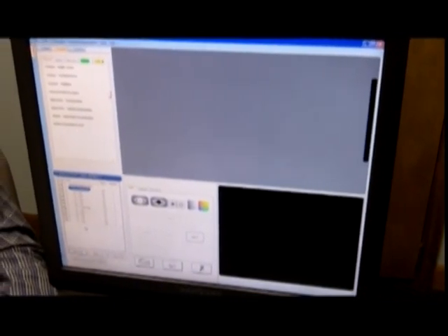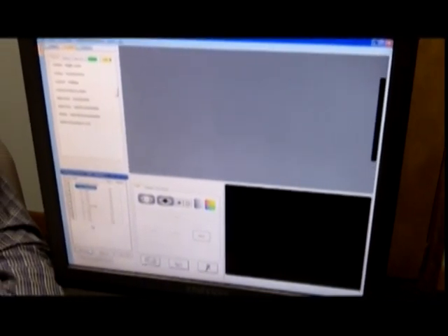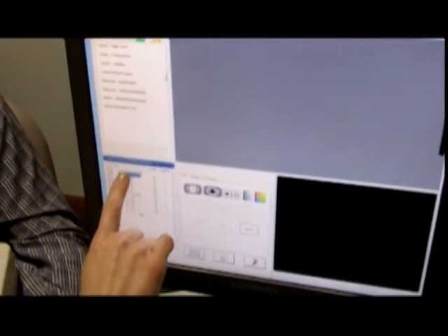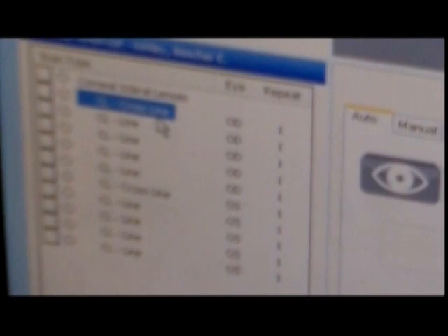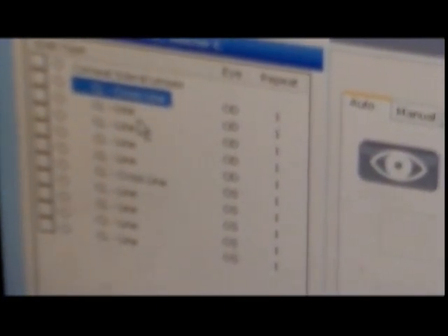We've created a corneal scleral lens protocol. Dr. Wilcox likes us to do, for each eye, a cross line scan and then four line scans: the top of the lens, the bottom of the lens, the right side of the lens, and the left side of the lens — just so we can analyze how the contact lens is sitting on the cornea.